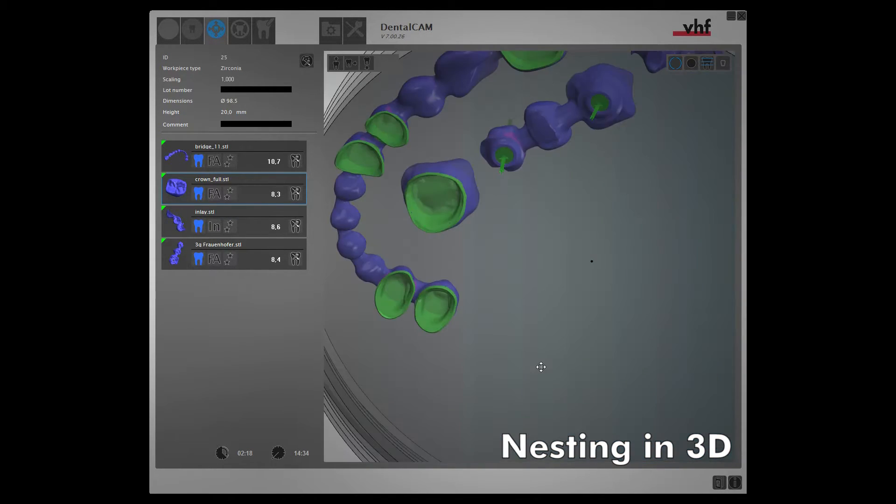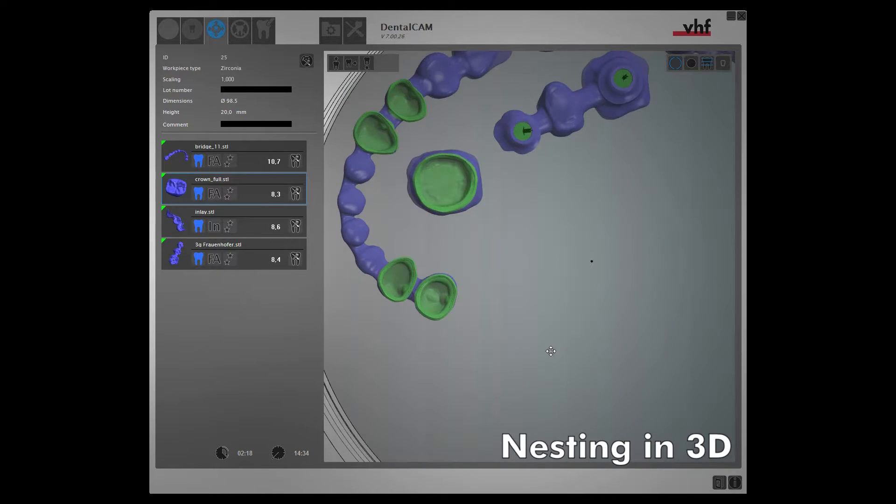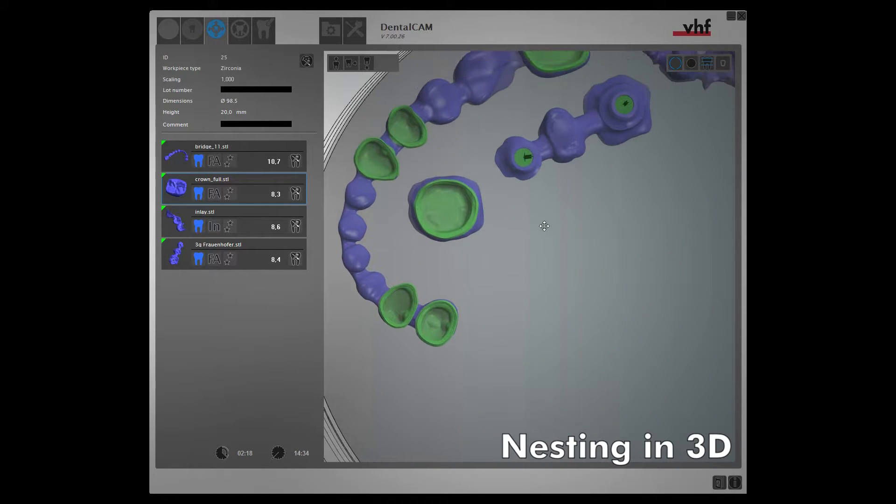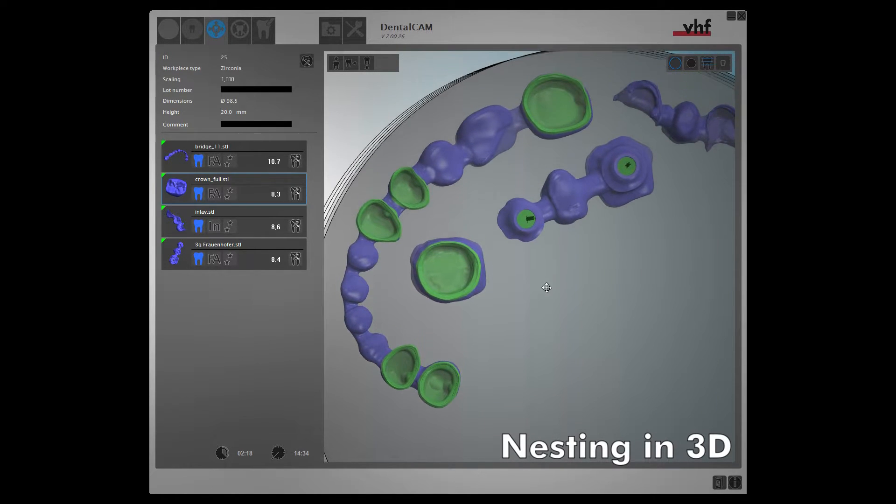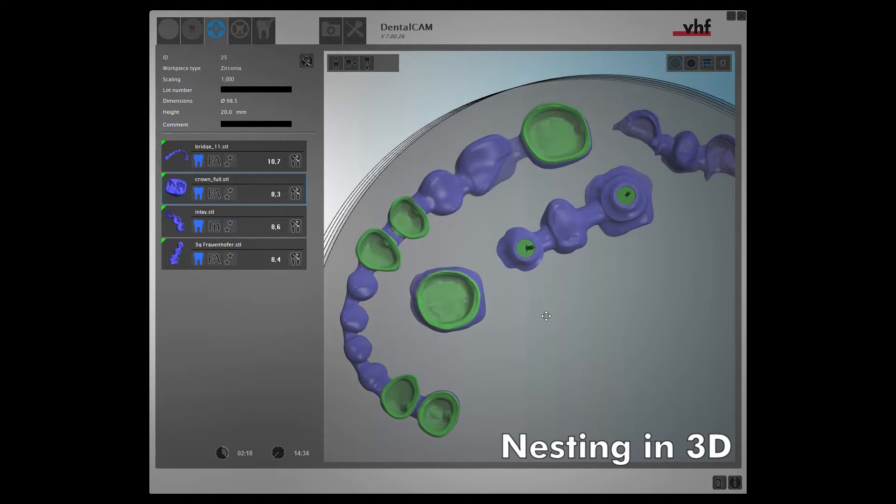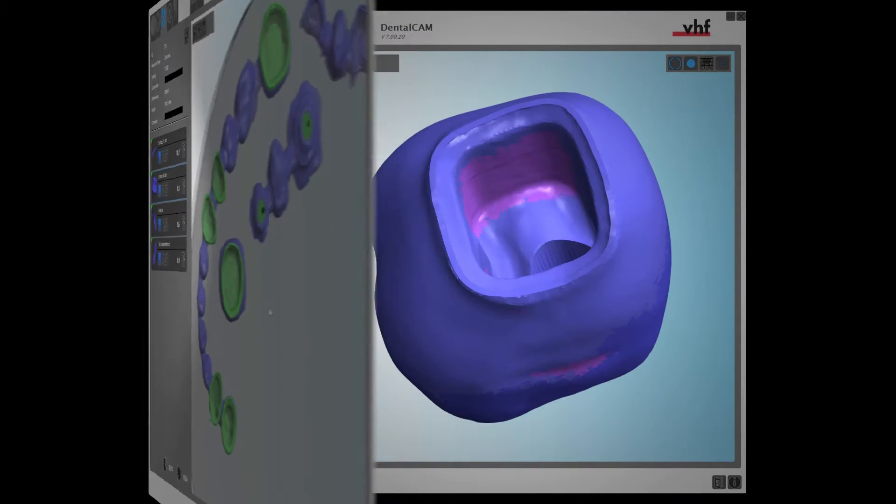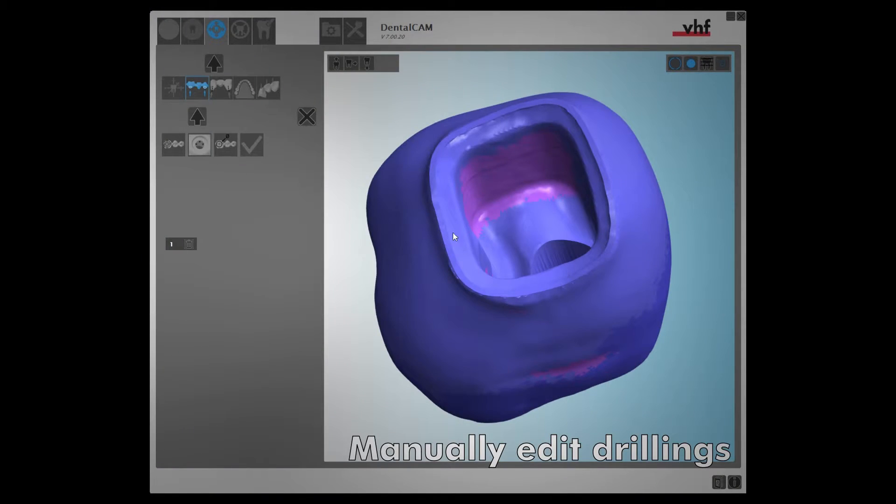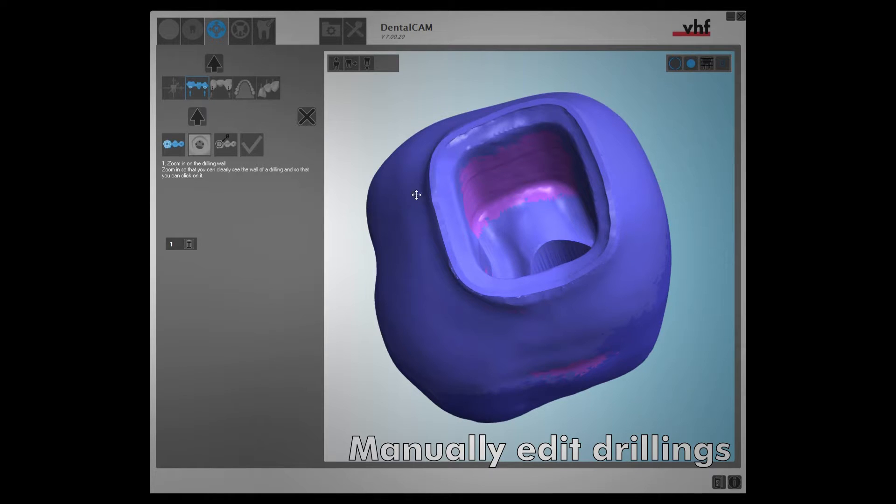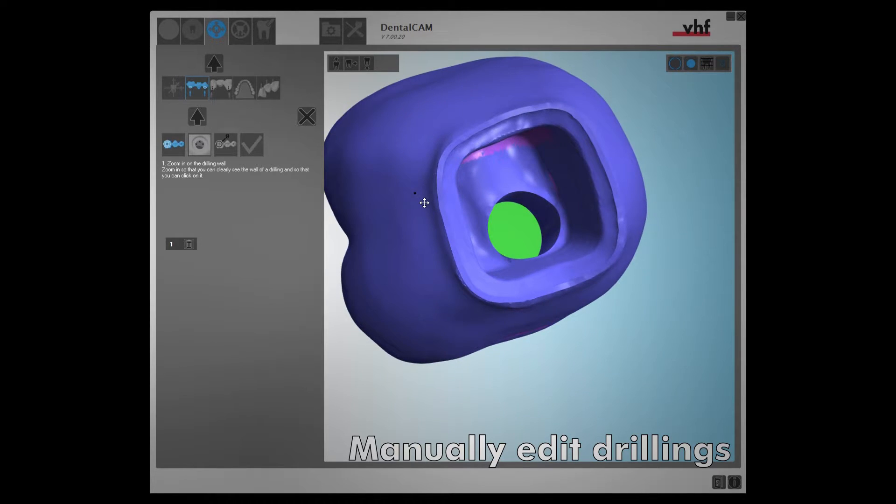Cavities and drillings are now easily indicated for easy inspection. DENTAL CAM 7 allows for automatic recognition of drillings and cavities, but manual selection is now also possible.